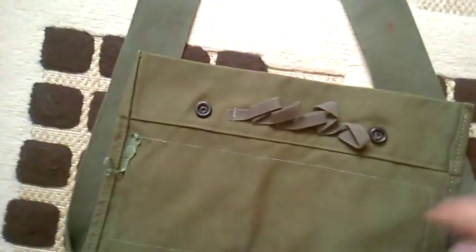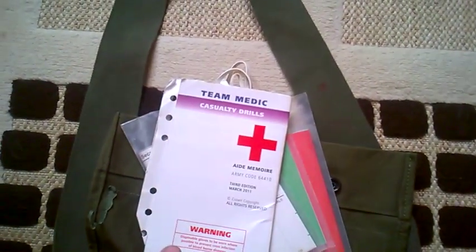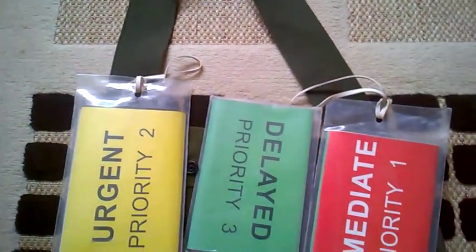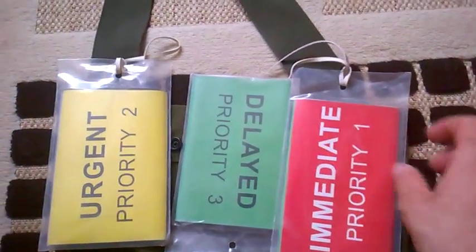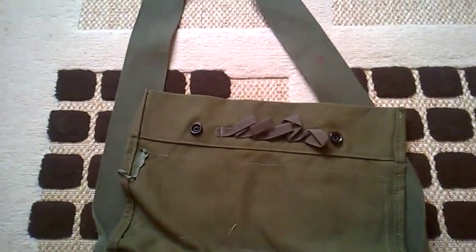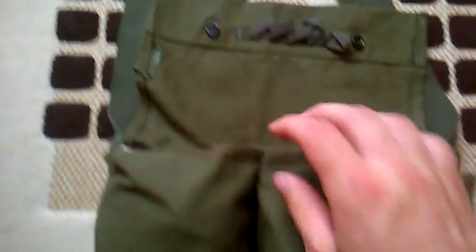We also have here, you've probably seen these before, the Team Medic Aid Memoir. I won't show you the inside of it because it's kind of restricted. And the priority delay cards, which you would have seen versions of in a previous video of mine. Those Aid Memoir cards would have been shown in one of my plate carrier videos.